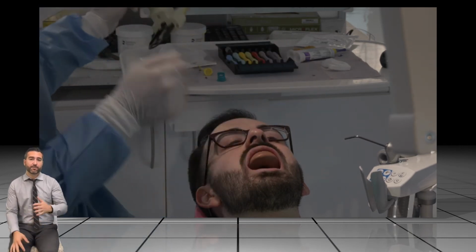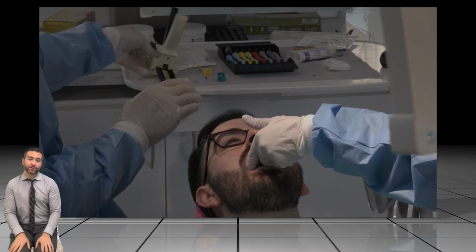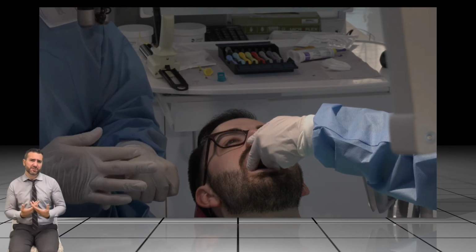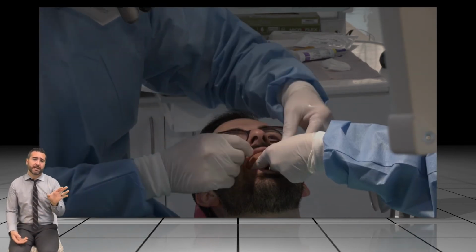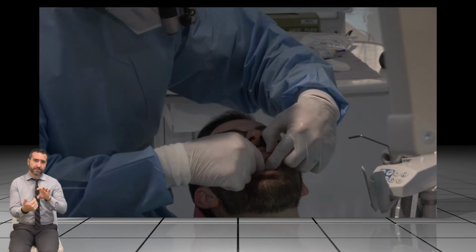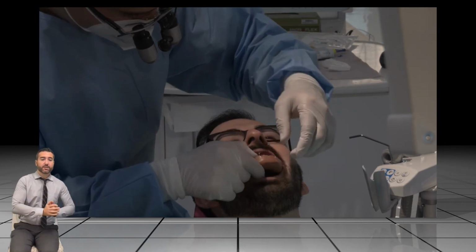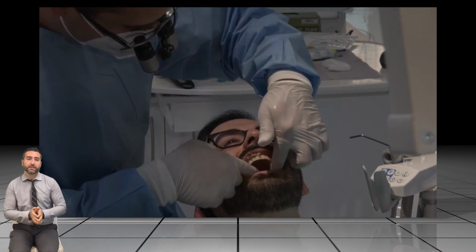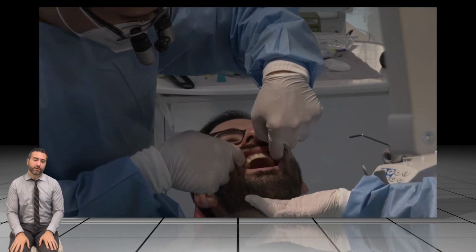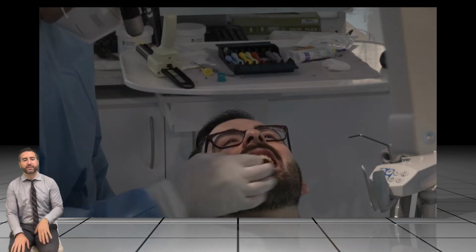I like to have all my patients involved in the wax up because they're truly blown away when you show them that wax up and you do this procedure for them. Versus if you think traditionally, what we used to do is snap an alginate, fire it off to the laboratory and get something back in physical wax, right? And then show the patient, you know, what do you think? Whereas this whole process where they see it first digitally, and then they see that digital become reality through 3D printing and injection molded kind of wax ups like this, the patients get truly invested in their treatment.